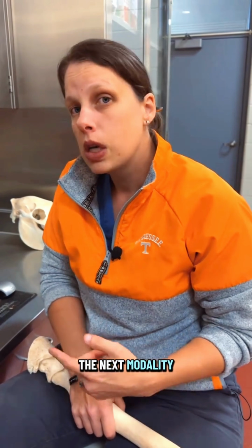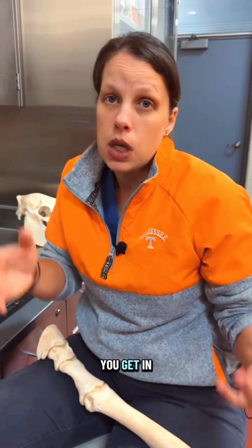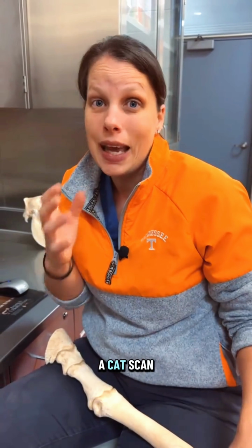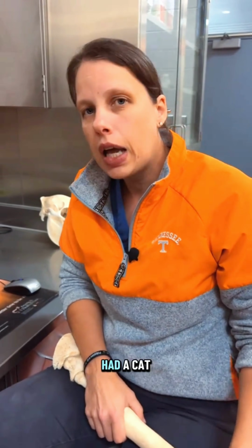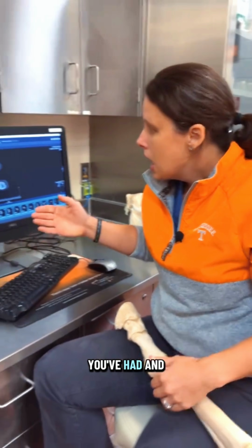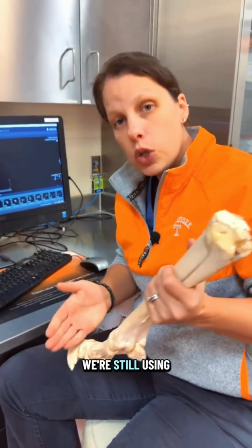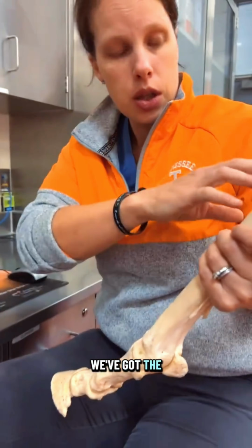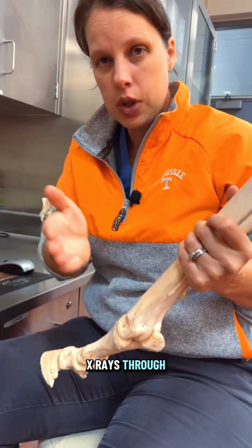The next modality we're going to talk about is a CT, or computed tomography. Also in humans, if you get in a car accident or had head trauma, a CAT scan, CT gets shortened to CAT scan for whatever reason. So if you've ever had a CAT scan, this is what you've had. And essentially it's the exact same thing as x-rays. We're still using x-rays. Again, we've got the generator. We saw the generator last time, and it sends x-rays through the air.